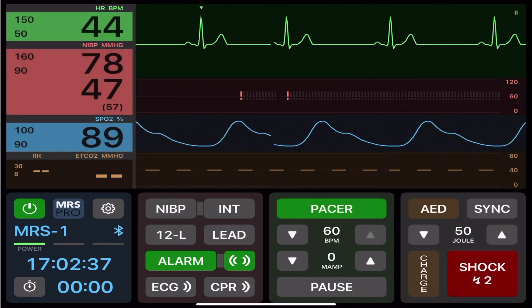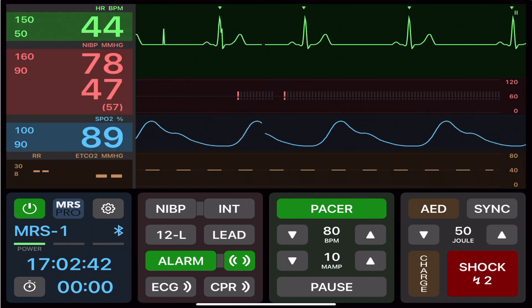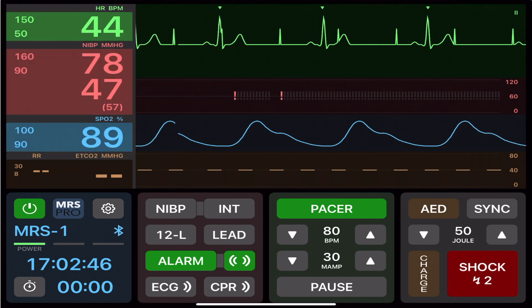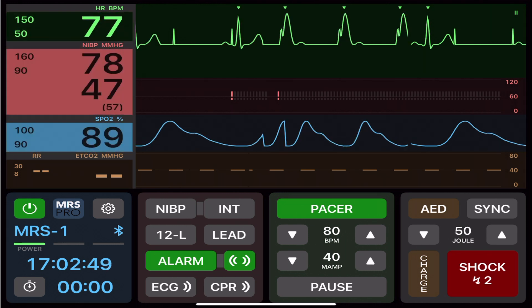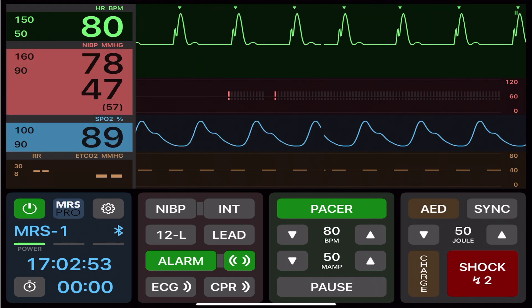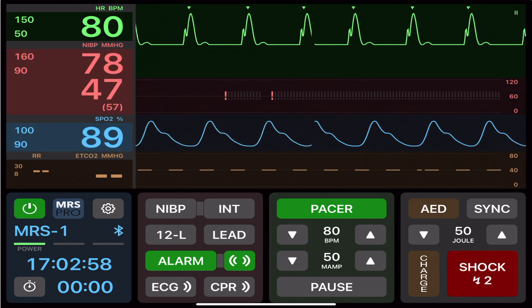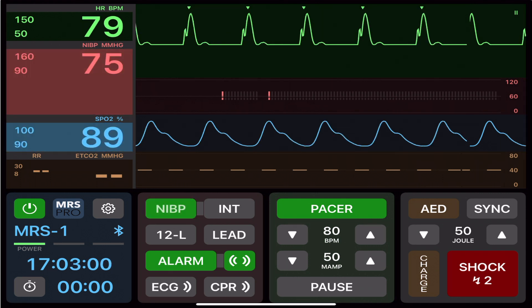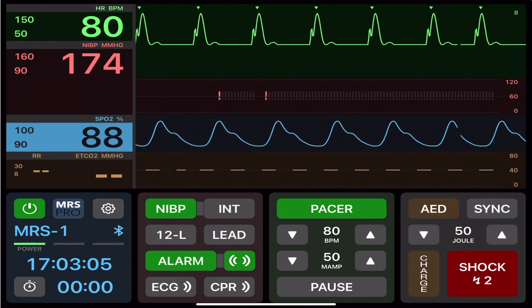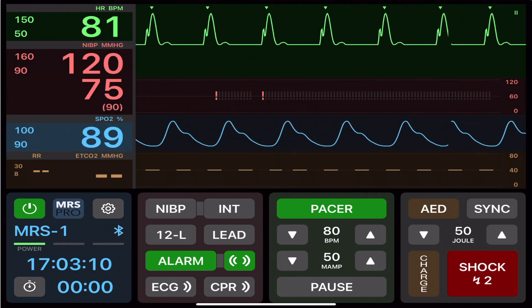Activate pacer mode, select the rate — I'm selecting 80 — and then increase your output until you have capture. For capture, we should see a pacing spike immediately followed by a wide QRS. When capture is achieved, we will go above the output level where capture was achieved to create a buffer. Don't forget to recheck your vitals.